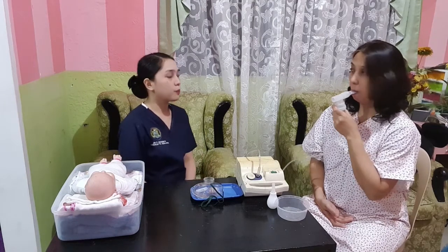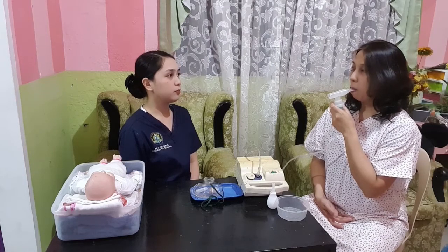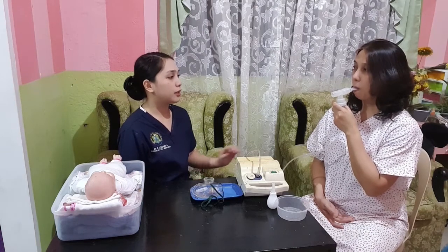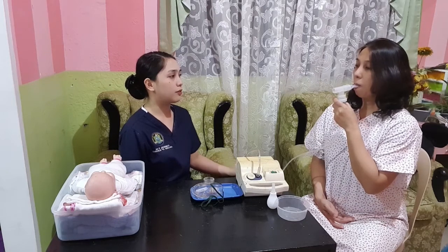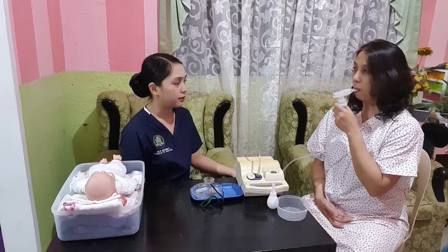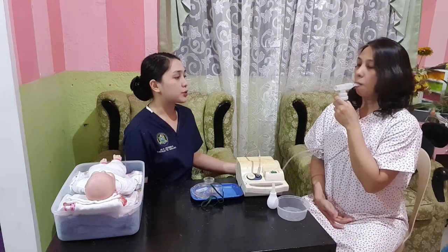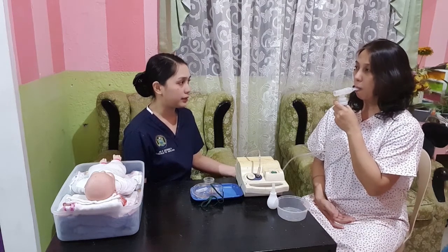So ma'am, can you inhale deeply, slowly, okay, slightly greater than normal. And then have a short pause. Okay, inhale deeply. And then have a short pause. And then exhale passively. Okay, again ma'am. Inhale deeply. Have a short pause. And then exhale slowly and completely.